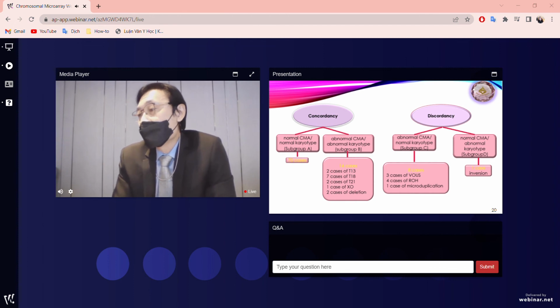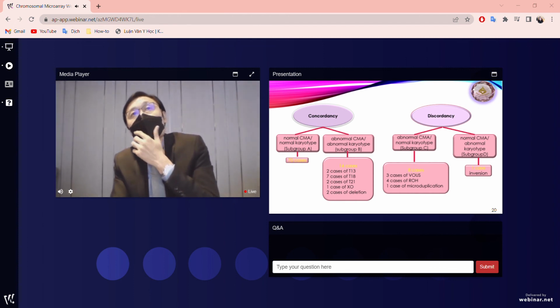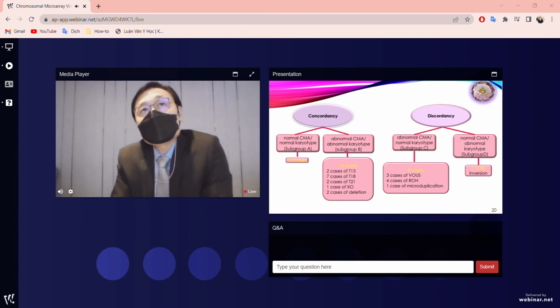Now, the results of our study were divided into the concordant and discordant groups. 70 cases in subgroup A had normal CMA and normal karyotype, while the 14 cases in subgroup B had abnormal CMA and abnormal karyotype. And then have a look at the discordant group. 8 cases in subgroup C had abnormal CMA and normal karyotype. And we found one case in subgroup D that had normal CMA and abnormal karyotype.